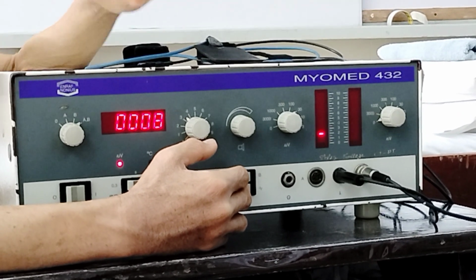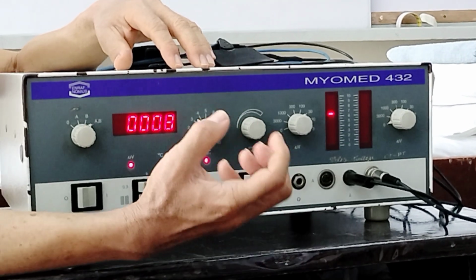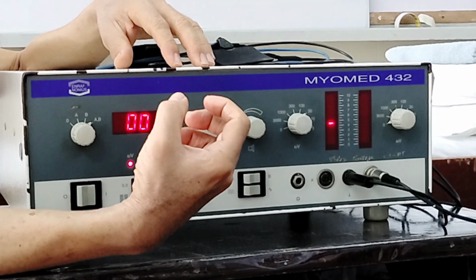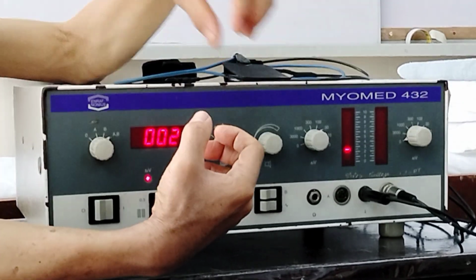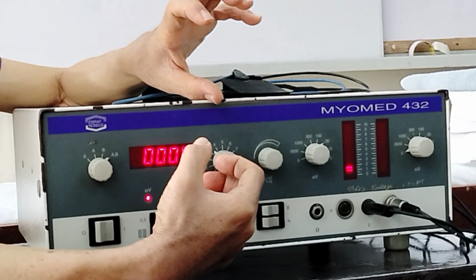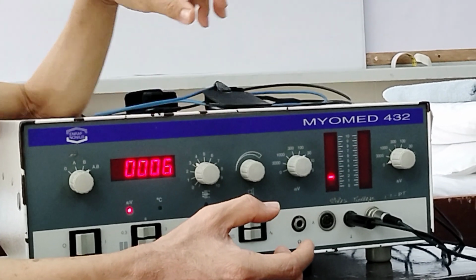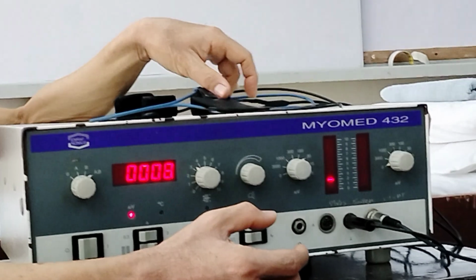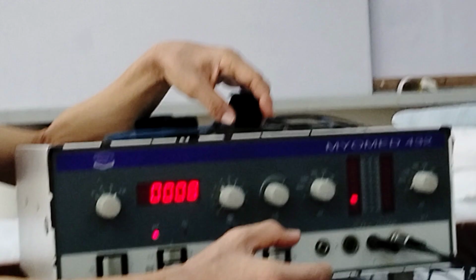Usually for relaxation, the muscle is either spastic, rigid, or tense. So if the muscle is spastic, the volume of the sound will be loud. The patient doesn't like to hear the rock sound, so he will try to relax in order to reduce the sound. Okay, that's one technique of choosing the type of sound to be heard by the patient.